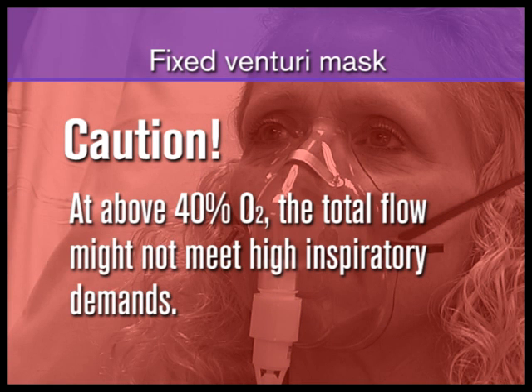At oxygen requirements above 40%, the valve may not generate enough total flow to meet high inspiratory demands.